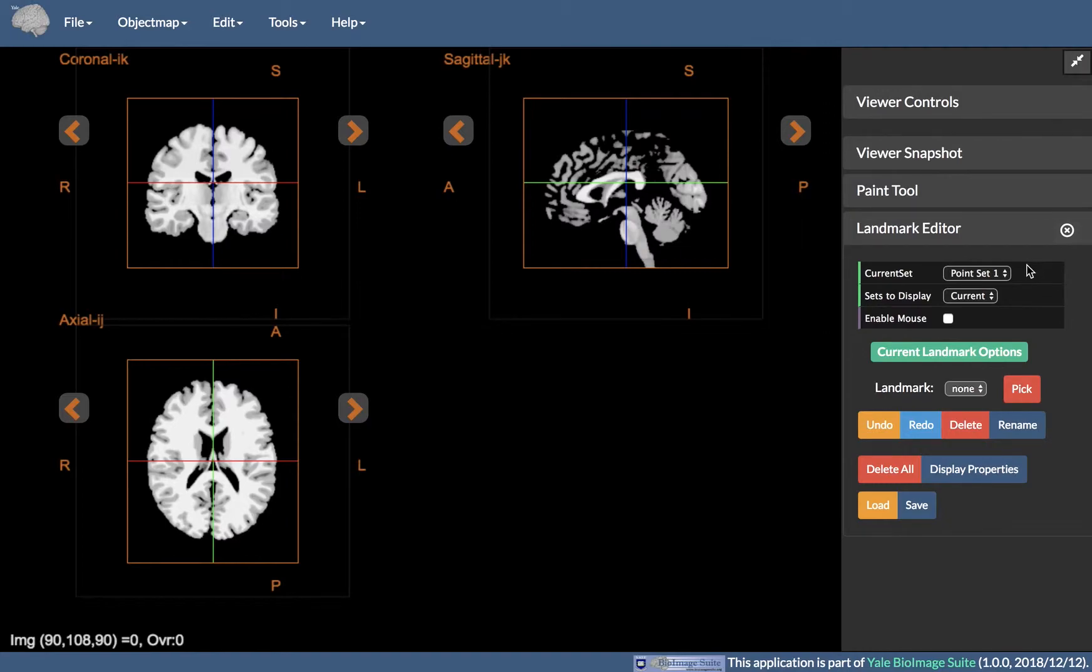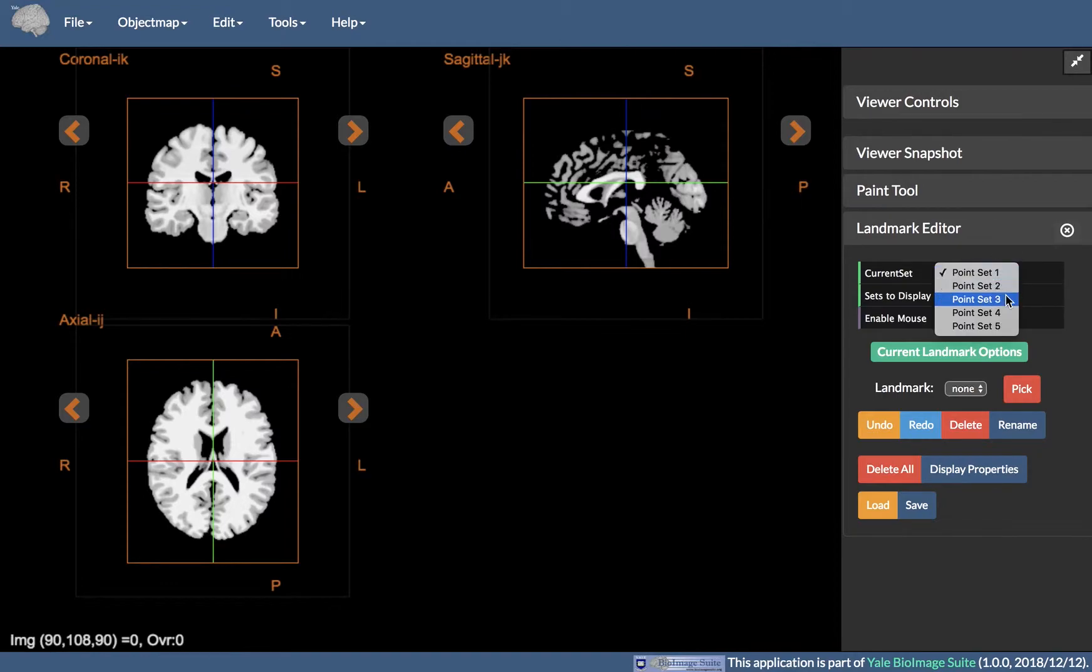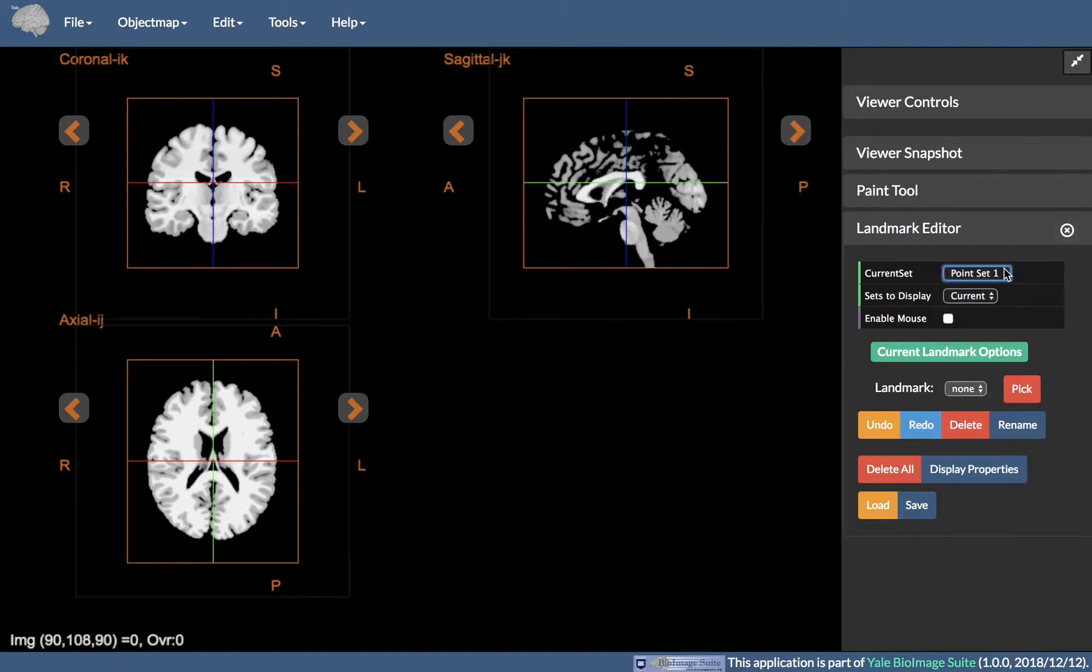The Landmark Editor tool has the following functionality. First, Current Set, where the Landmark Editor allows for up to 5 different sets to be recorded, each labeled Point Set 1 up to Point Set 5.